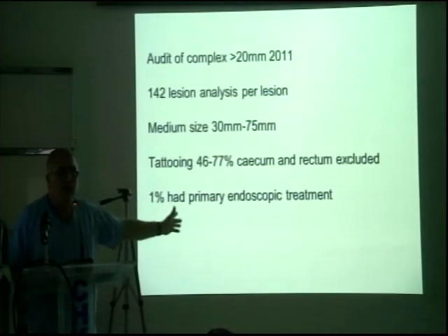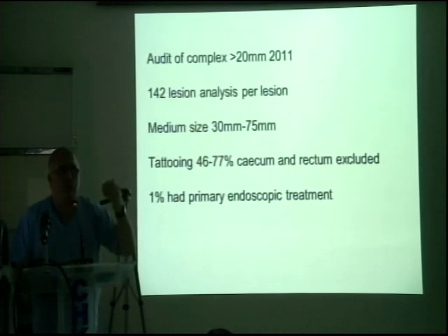So there's a polyp, 3 folds distal to the IC valve. As you look at the IC valve, at 8 o'clock, the polyp is positioned there. Be prescriptive, be descriptive. That's where it is. I have now gone into the rectum. Valve of Houston, 3rd one, adjacent to, at the 6 o'clock position. All right, so very prescriptive.